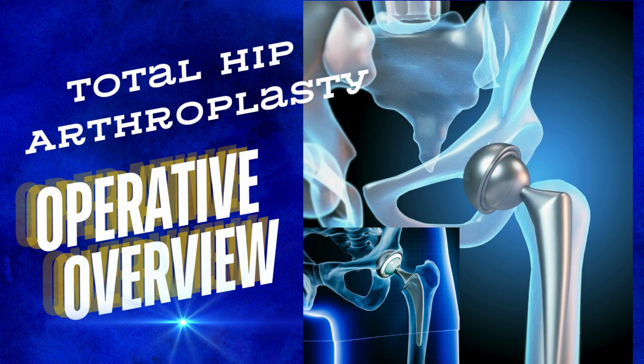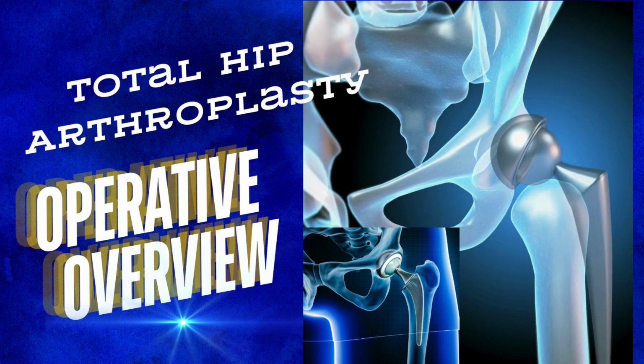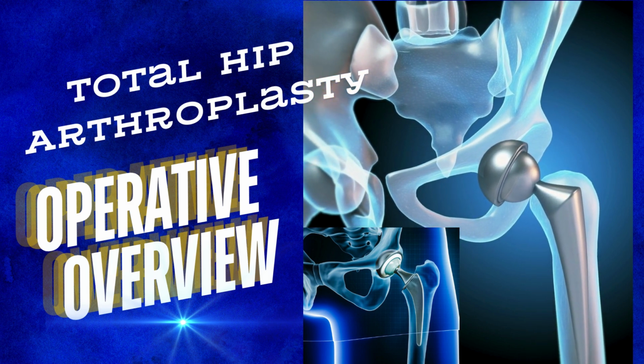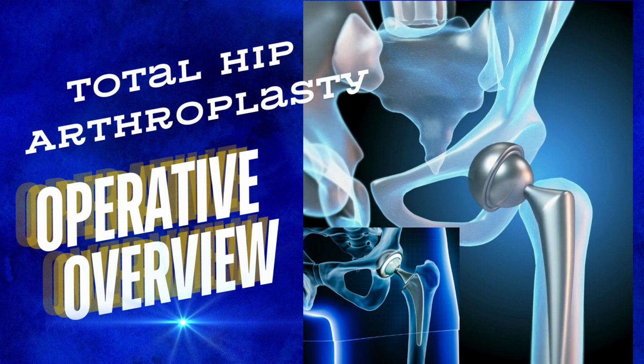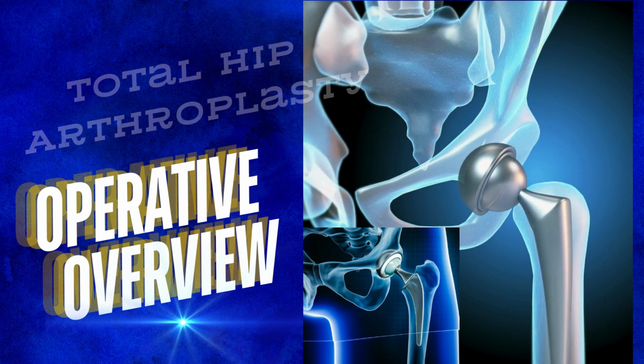The surgical approach used will be determined by the surgeon and is typically a single incision along the posterior, lateral, or anterior aspect of the hip. Less invasive hip replacement surgery techniques, which use smaller incisions and specialized instruments, are often used.